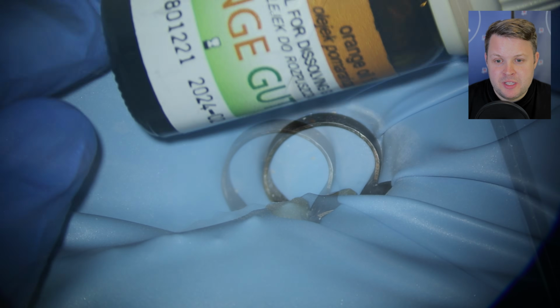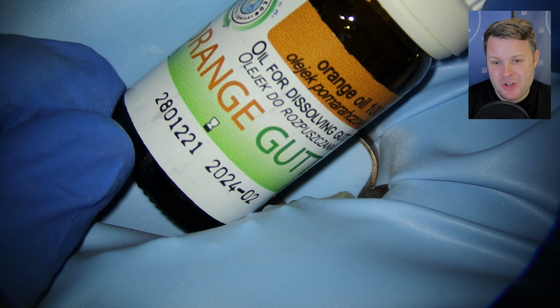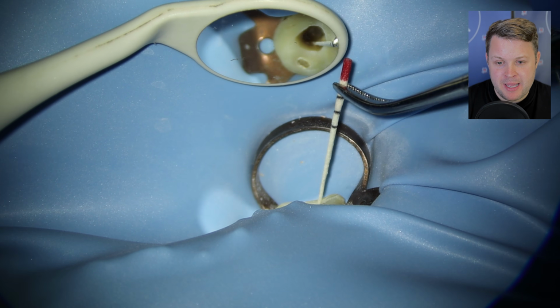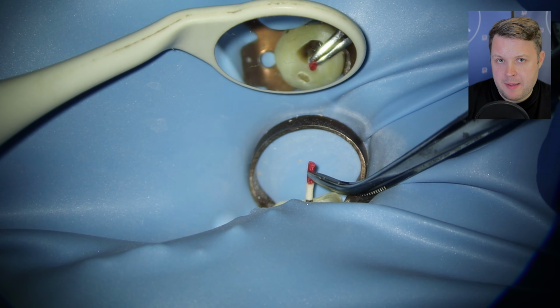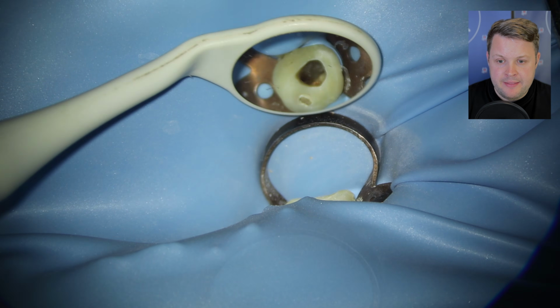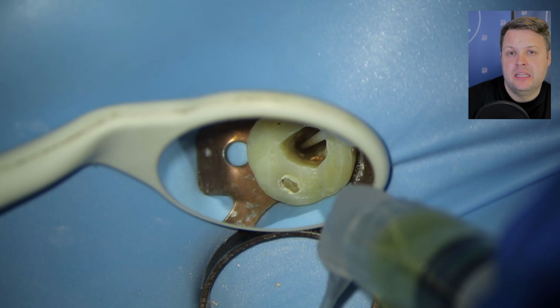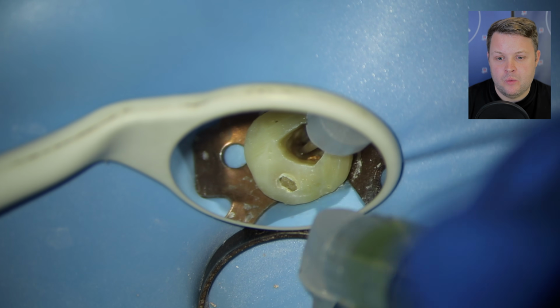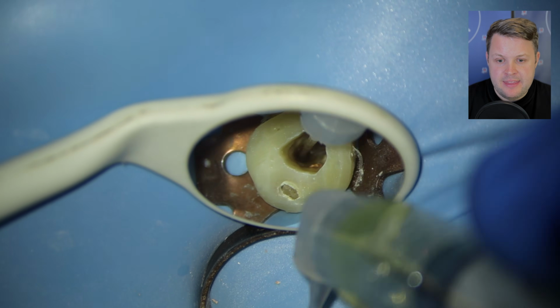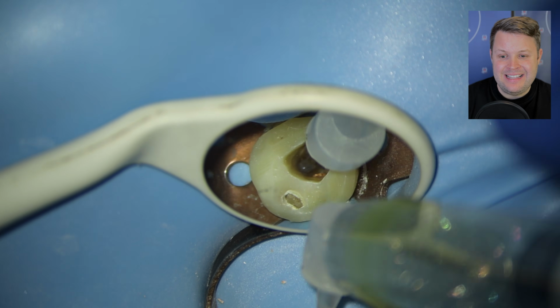And we're going to use the last resource. We're going to use some solvent. This is orange oil. What I'm going to do here is wick out the remaining sodium hypochlorite. Again, I don't think sodium hypochlorite reacts negatively with this orange oil, but I just don't want to be too sure. And then I am just going to irrigate the canal space with this orange oil and let it really, really soak in. And now I'm using a size 8 C+ file.